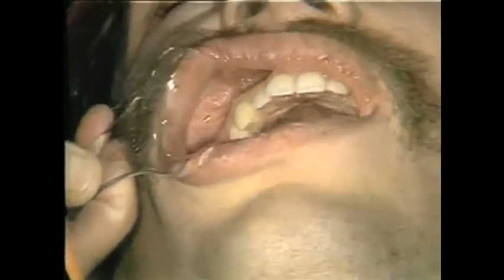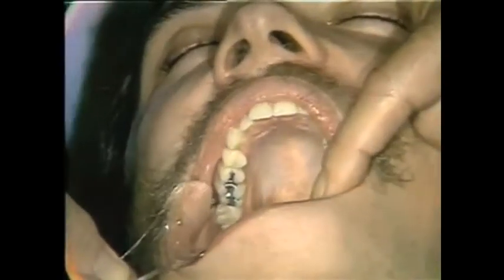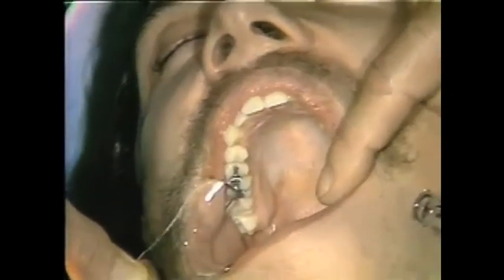Now, once again, if we were just involved with one tooth or the instrumentation upon palatal tissues associated with one maxillary tooth, it wouldn't be necessary to block the entire anterior palatine nerve. Let us suppose we were going to remove the maxillary first bicuspid. I'll let you slip your retractor in there again, please. And you might turn away from me just a little bit. That's fine.